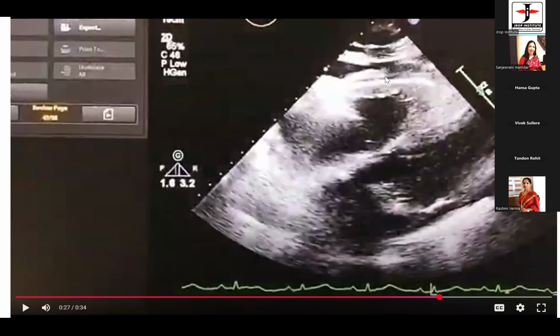Whenever there are... see, the epicardial fat generally moves with the myocardium. But organized, semi-organized effusions may move independent of the myocardium. It can also be a situation wherein you get fibrous bands, a lot of coagulum and blood inside, which is organizing in cases of hemopericardium. In those situations, wherever you get this kind of material, it will move independently. But the epicardial fat usually moves with the myocardium.